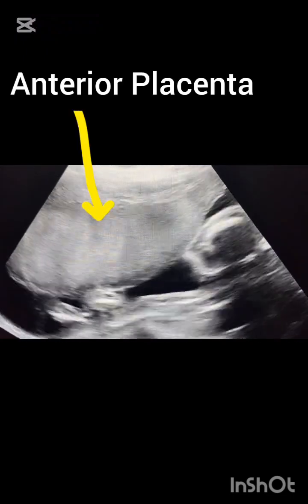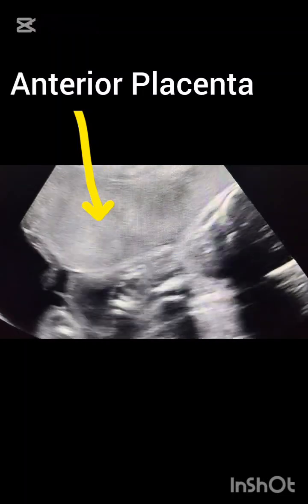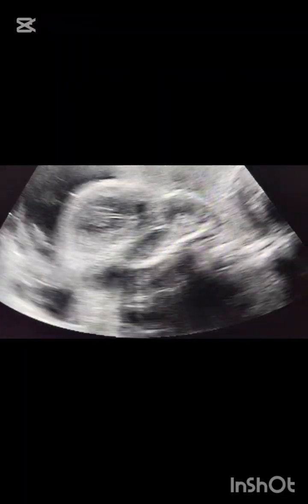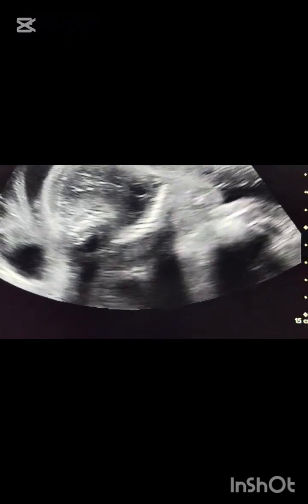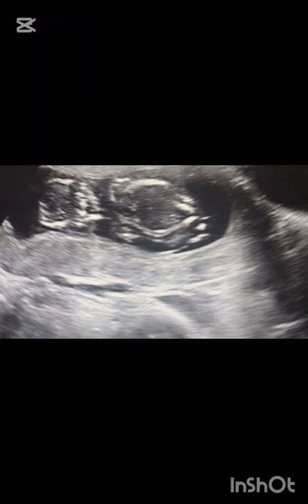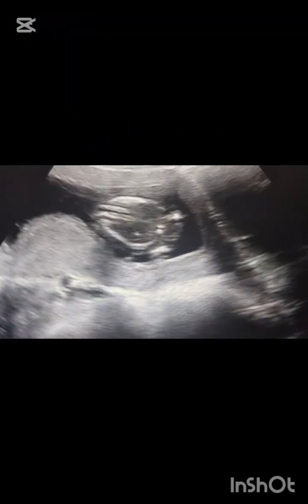In this second video, you can see the placenta is anterior. This is the most common position — the placenta is anterior in the upper segment. This is showing an intrauterine fetal demise with overlapping skull bones and the fetal brain visible.